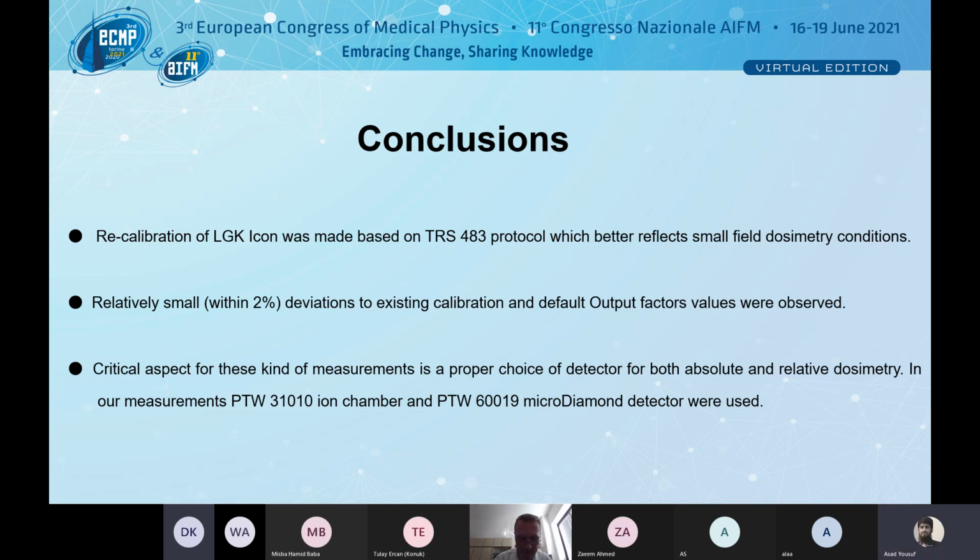Okay, I want to know whether it is only applicable for CyberKnife, Gamma Knife, and tomotherapy, or also for Linac-based SRS systems. Well, I am not a Linac guy now, but as much as I know, you should have those, especially FFF filter-free beams. Yeah, triple F Linac beams.